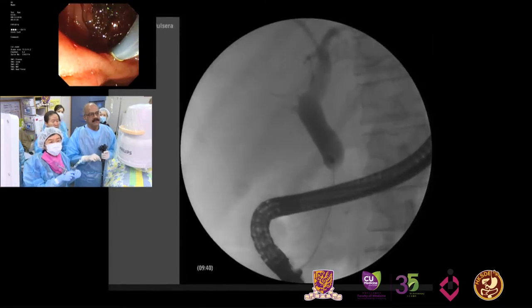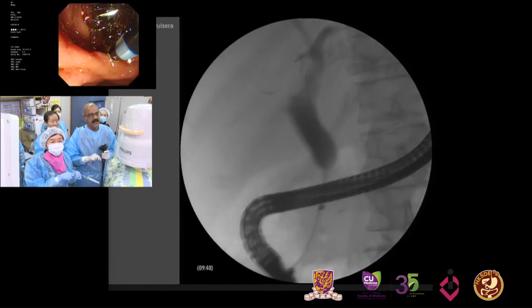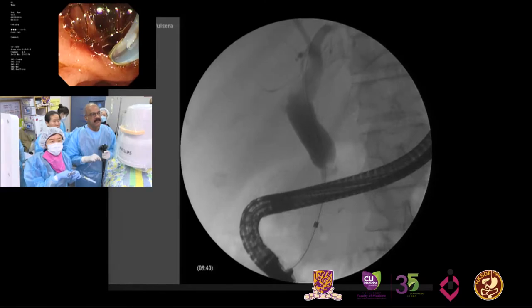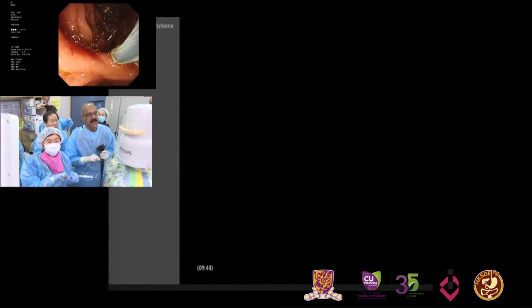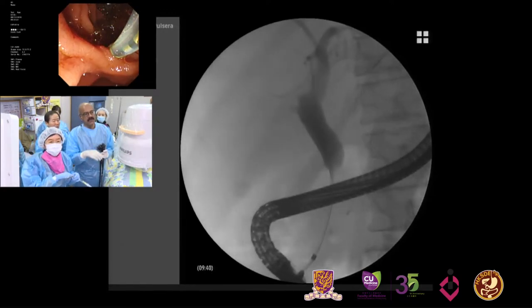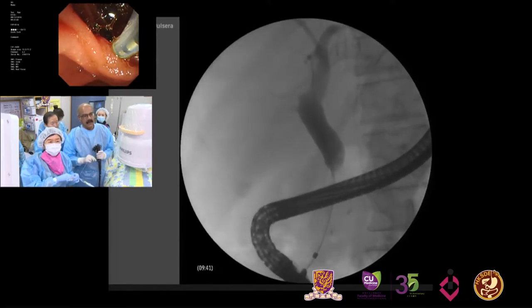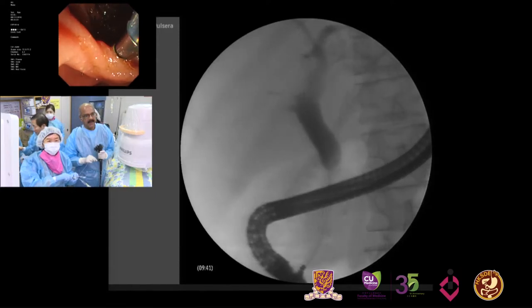I'll come back with my sphincterotome. Keep pushing. So this is a common question often asked by ERCPists: how do you measure the stricture size? Very important. So now I'm going to get my sphincterotome out, and as I get my sphincterotome out to the edge there, you see the sphincterotome is right at the top of the stricture, right? You can see that? Now I'm going to just pull back on the sphincterotome, pull back.